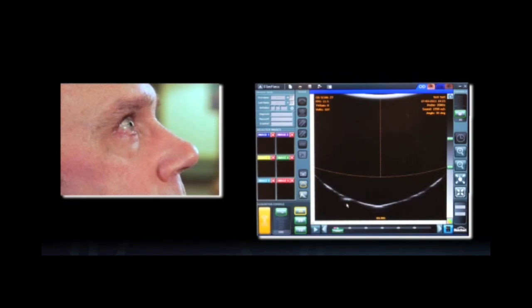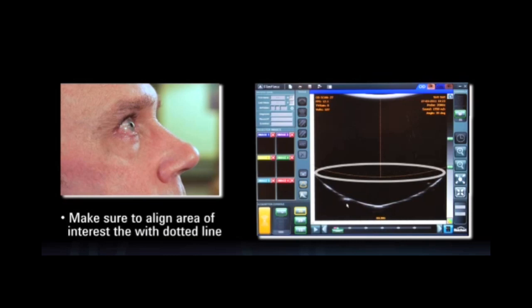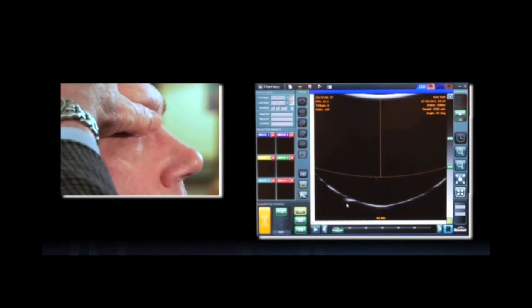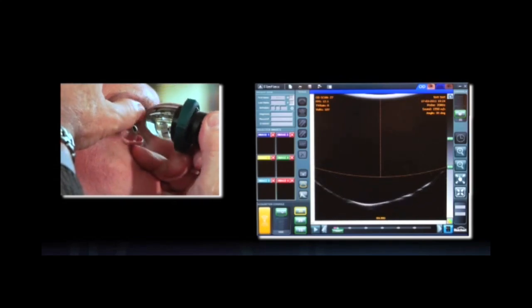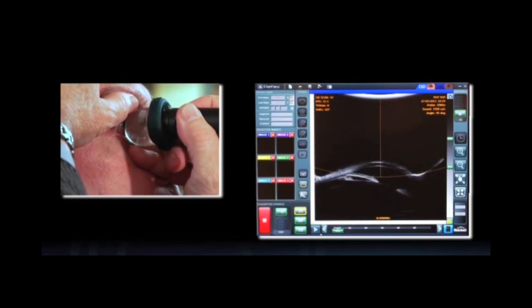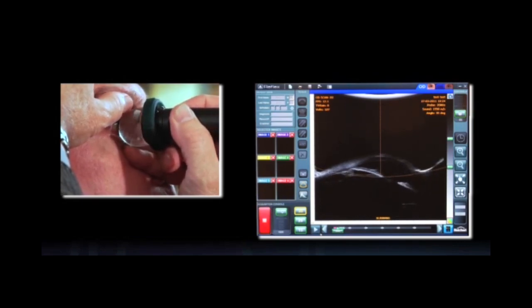There's an optimal position on the screen that denotes where the greatest sensitivity is. And so I want to have the angle or whatever I'm interested in, be it a cyst or a melanoma, pictured on that line, on that little dotted yellow line. I'm going to use that faux speculum technique, look up. I'm looking, I have that conical bullet. Everything looks well positioned. Now I'll go look at my screen.